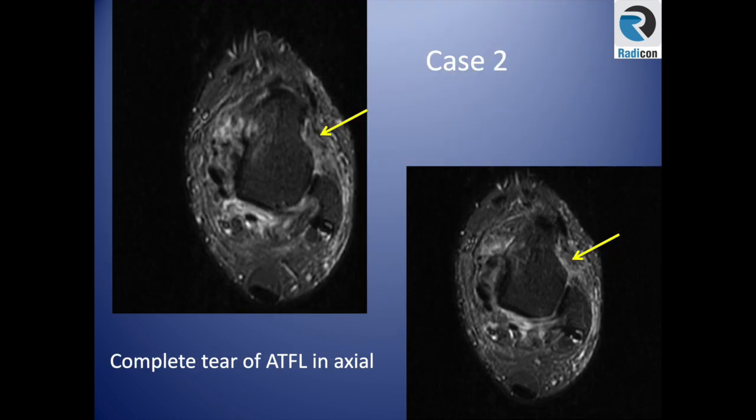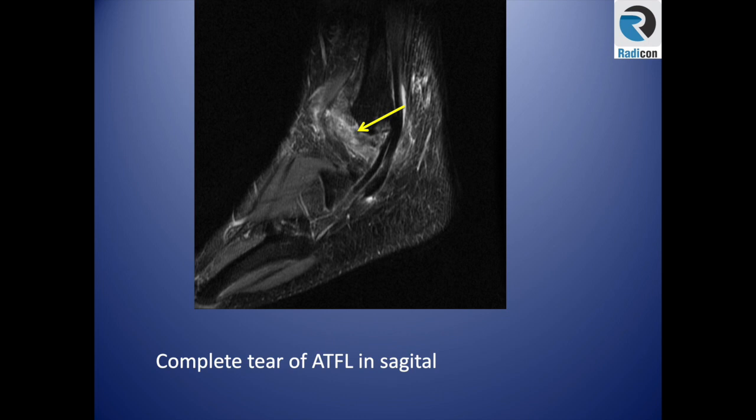Case two: axial images of the ankle at the level of the coma-shaped fibula, confirming we are at the anterior talofibular ligament level. There is complete absence of the ligament with a slight wavy appearance of the residual fibers and surrounding edema — another case of complete tear. On the sagittal plane, the band extending anteriorly is absent.